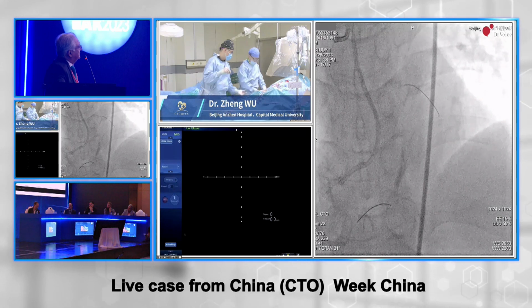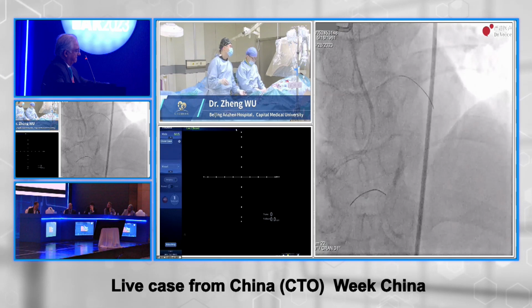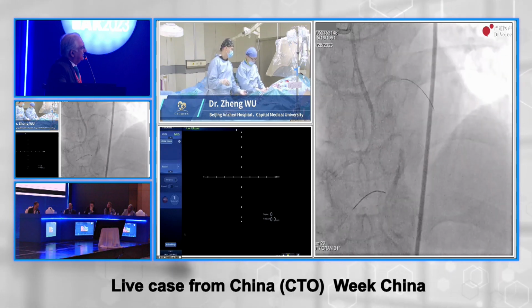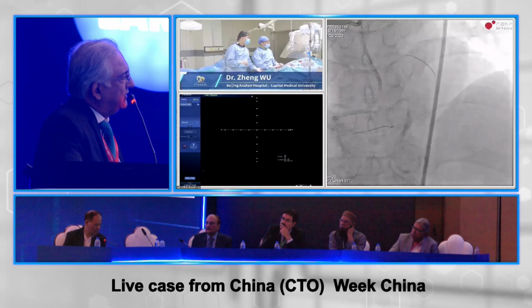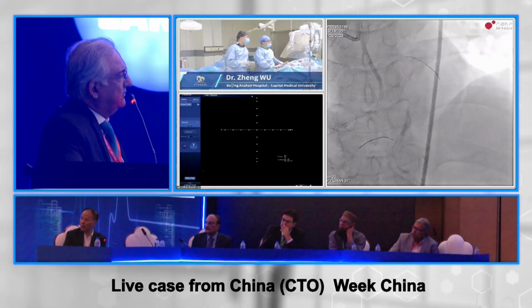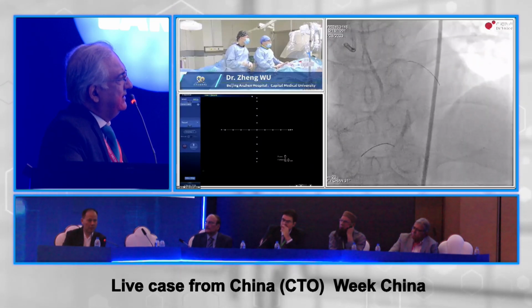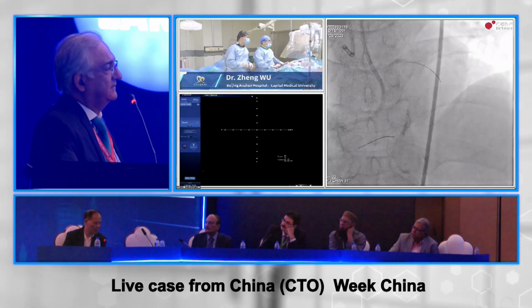I think it has some method to deal with the problem of the much resistance because of the calcification. We have 5 more minutes of satellite and then we have to go off. So I wonder how much progress we'll make. Can I give one more comment? Yeah, please.